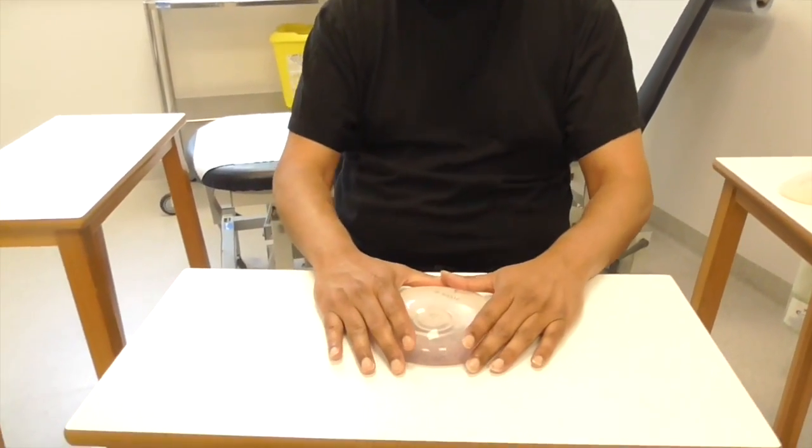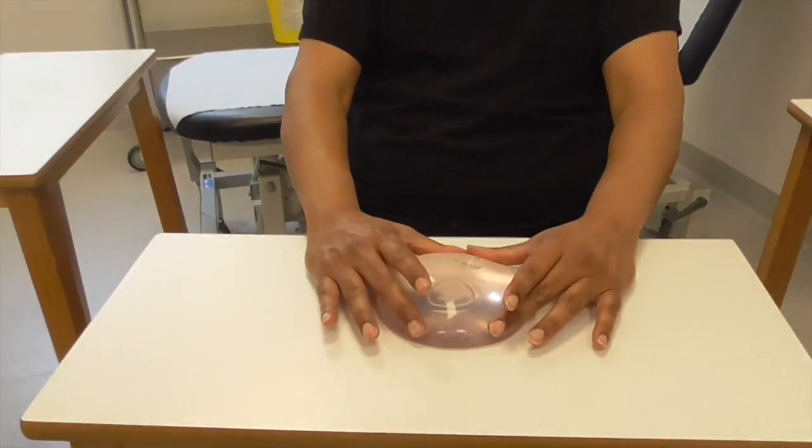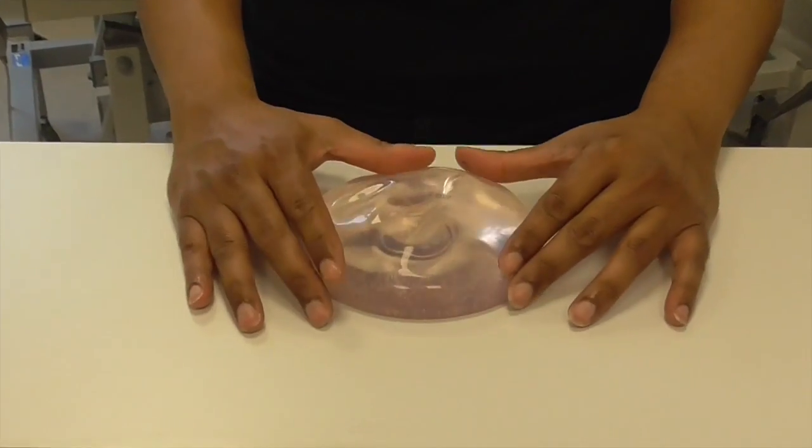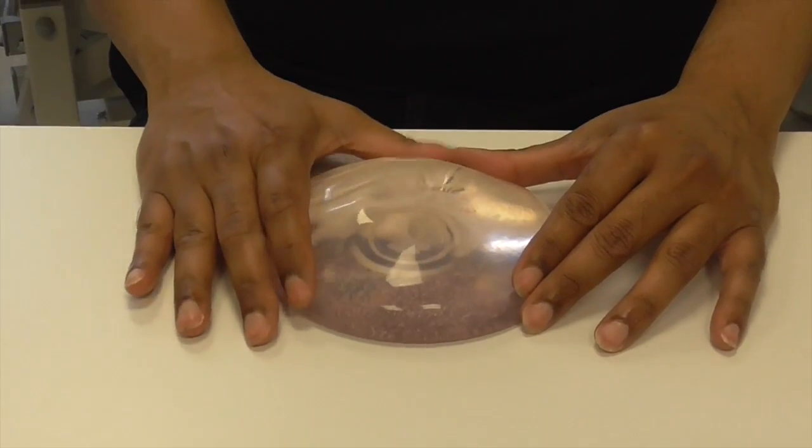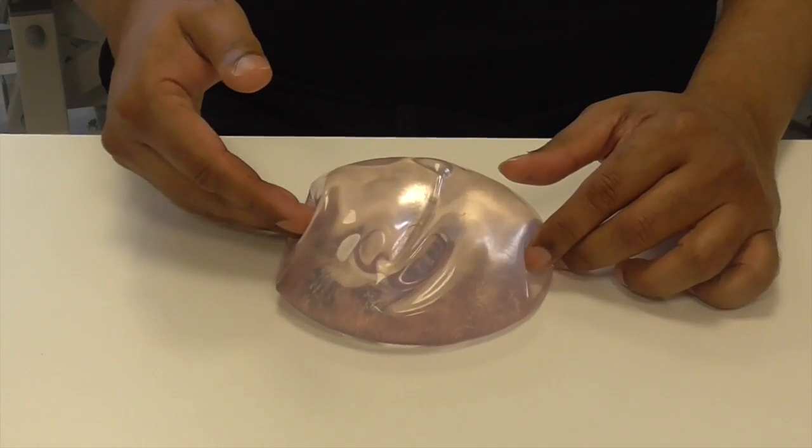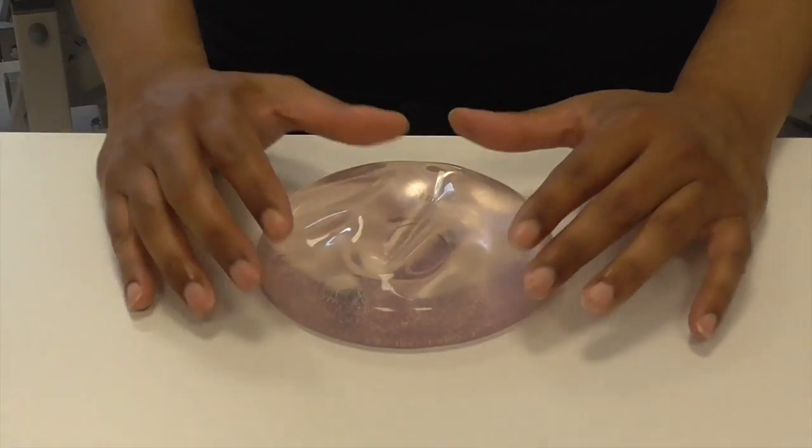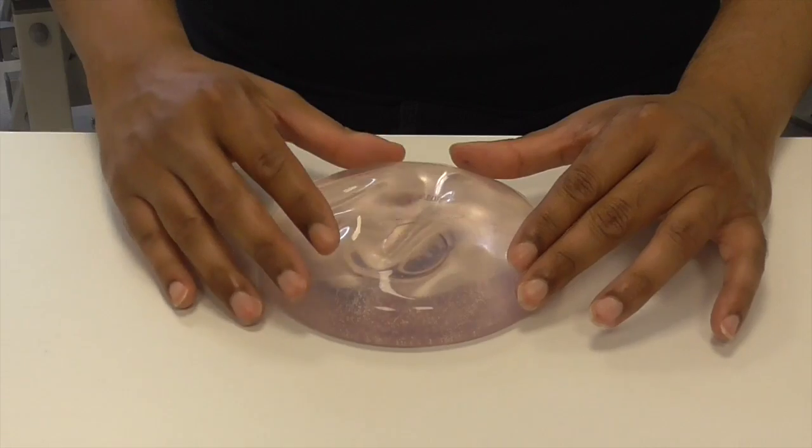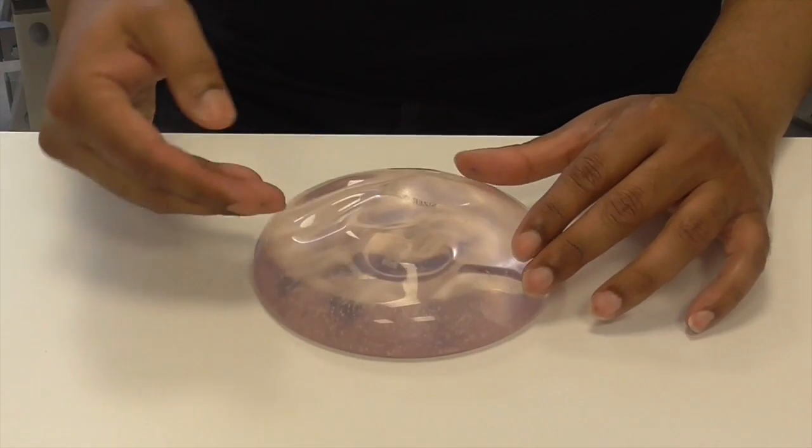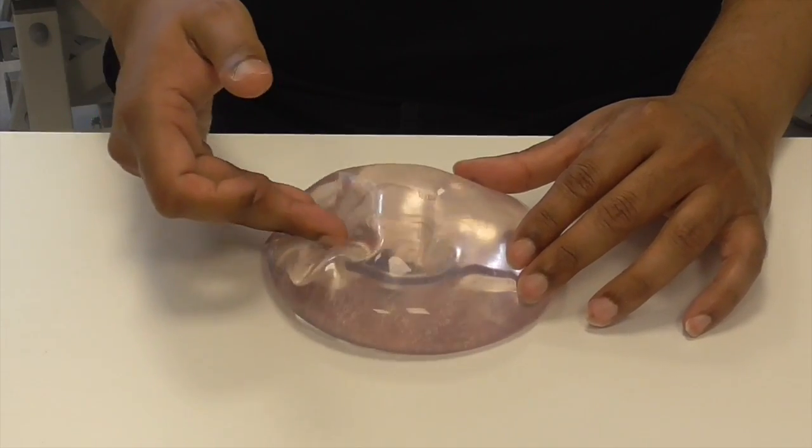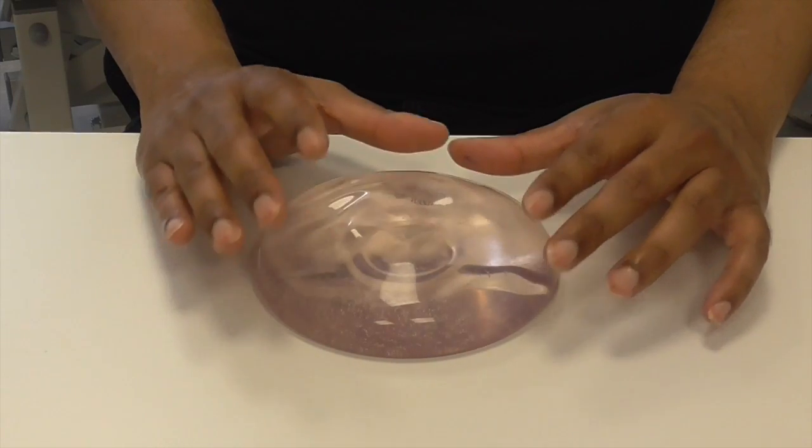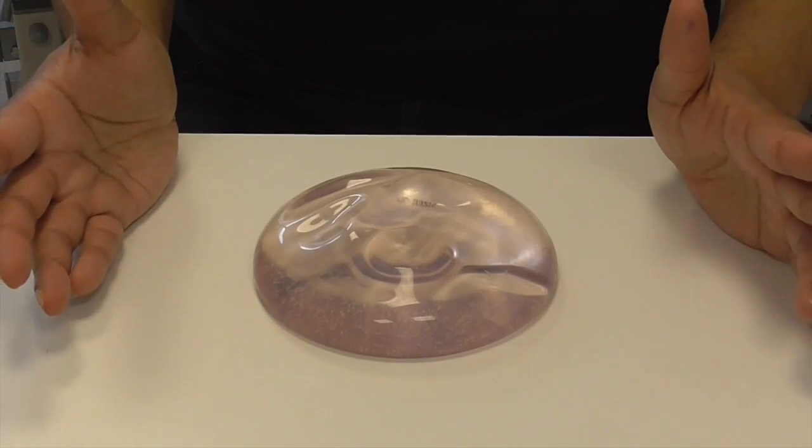If we look at the breast implants used in the United Kingdom, the vast majority, 90 plus percent, are a silicone shell with silicone gel on the inside. There are some ladies who have implants where the filling is not silicone but is made of soya bean oil, which they call trilucent implants.